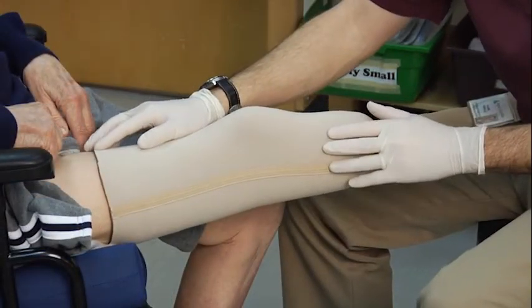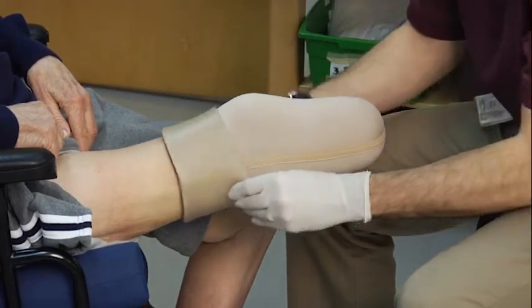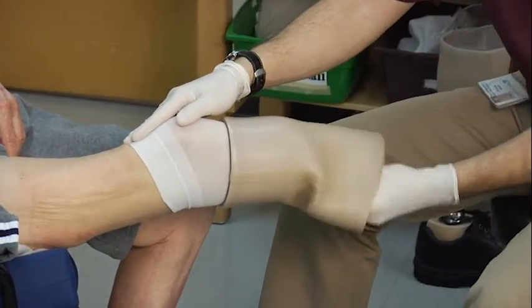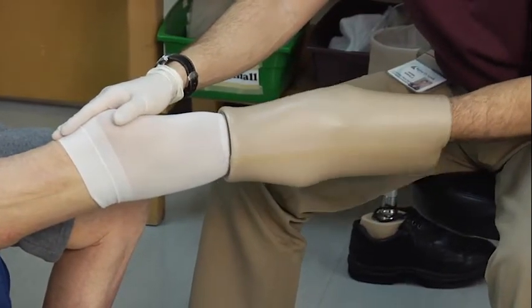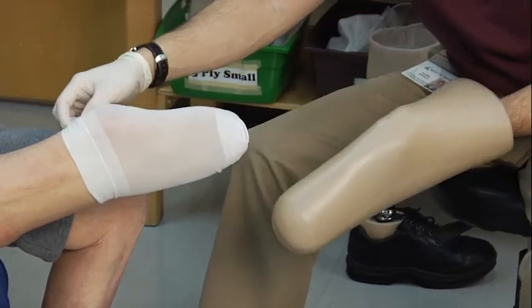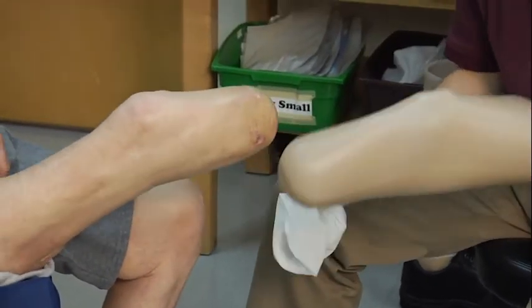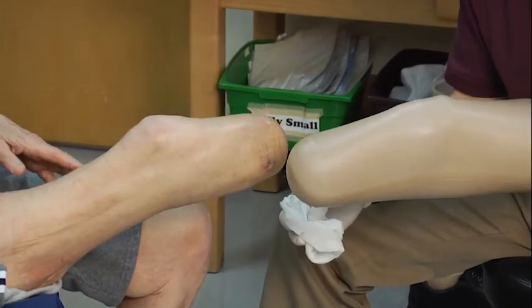To remove the gel liner, I'm going to roll the liner off and make sure the sheath doesn't move as we completely remove the liner from his leg. I will then remove the sheath and inspect around the incision line to ensure there are no red marks or any skin issues that may have occurred from wearing the gel liner.